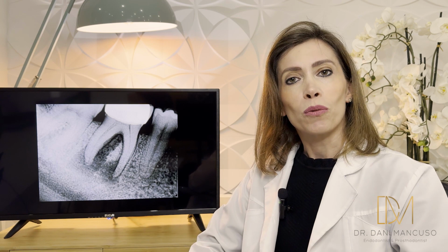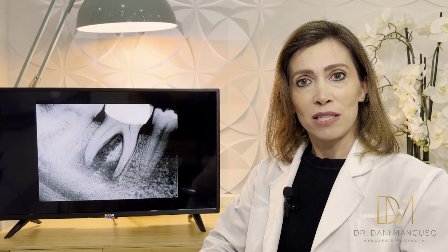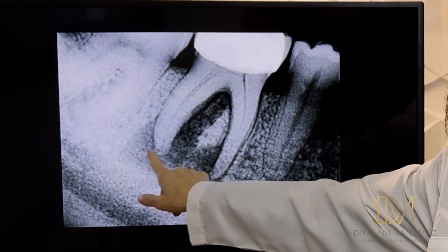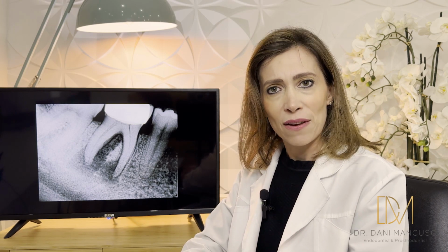But last episode, we spoke about the lower left 6, and we had a J-shaped lesion around the distal root of that tooth. Today, we are going to talk about a different tooth, a lower right 6, and the J-shaped lesion has a different shape. It's on the mesial aspect of the distal root and involved furcation. When this patient came to see us here at the Specialist Endodontic Center, we had some doubt regarding whether we could save this tooth initially when we saw the X-ray.